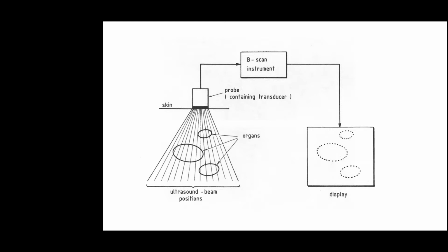There have actually been, for a few years, three-dimensional probes that can be used. It's just the same thing, but basically these lines are transmitted in 3 dimensions. So instead of forming this kind of triangle, they form a triangular prism.